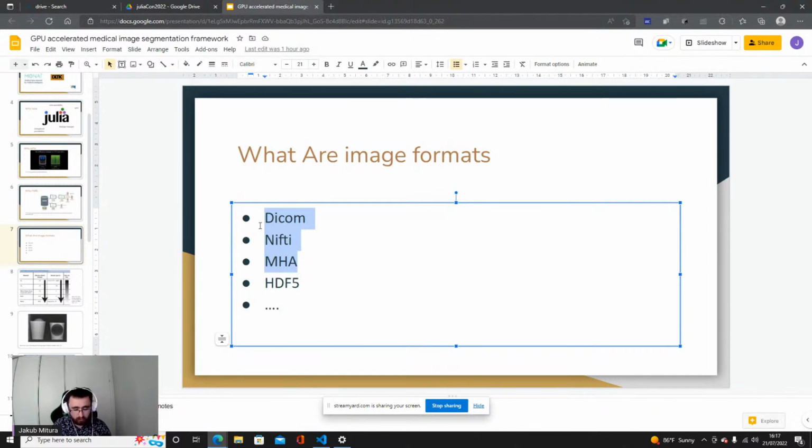It can be in DICOM, it can be in NIfTI, it can be in RAW, it can be in MHA, sometimes it can be in HDF5. So it's important to load all of it, parse all of it, and pre-process all of it in a way that would be useful for you.